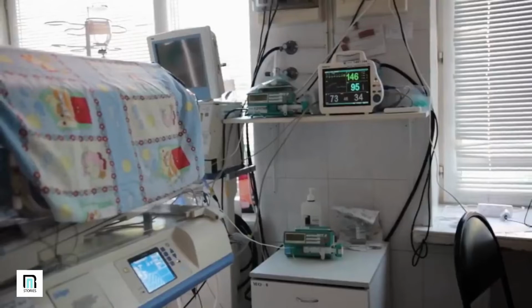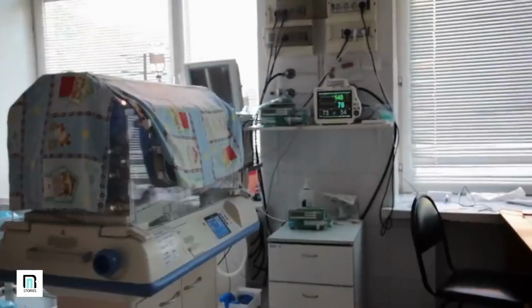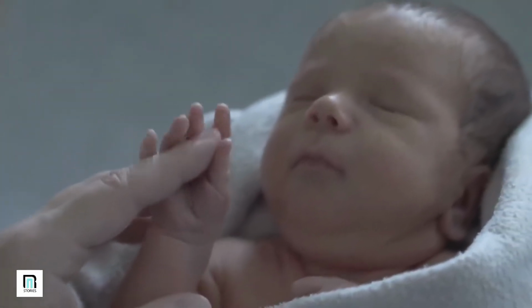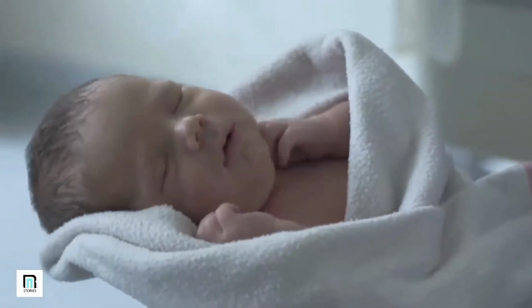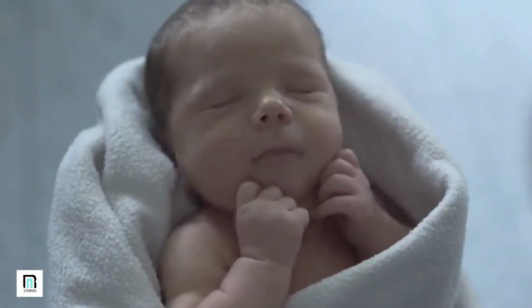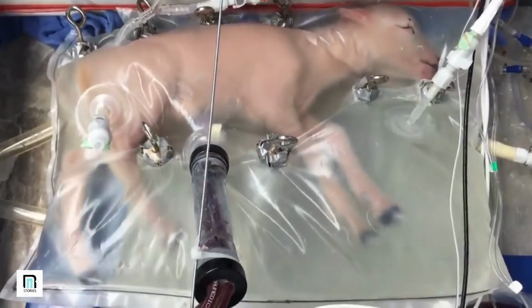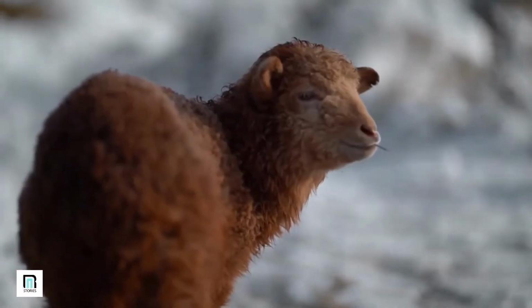He also plans to make the device parent-friendly, allowing parents to communicate sounds to the baby and see it with a camera. Marlowe says this is an important consideration as having a premature infant can be extremely distressing for parents. On the whole, Marlowe is optimistic about the device and shares similar concerns to Turner. Anything that is more gentle and interferes in normal development as little as possible is to be welcomed, says Marlowe, but we need to keep an eye on the risks.